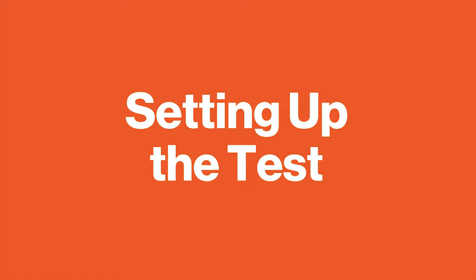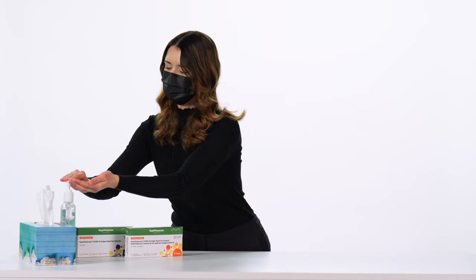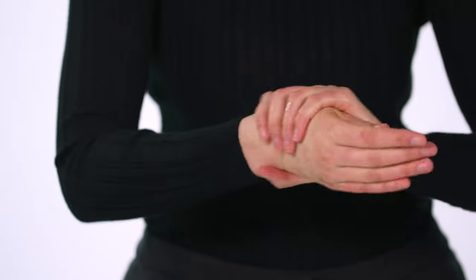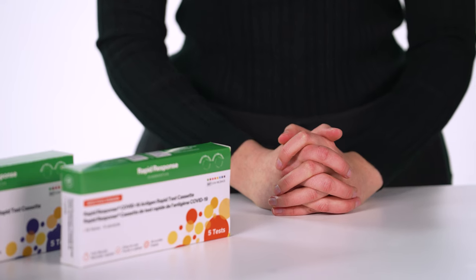Setting up the test. Bring all test materials to room temperature — 15 to 30 degrees Celsius — before starting the test. Wash your hands thoroughly with soap and water or use hand sanitizer. Make sure they are dry before starting. Unpack the test components from the kit.